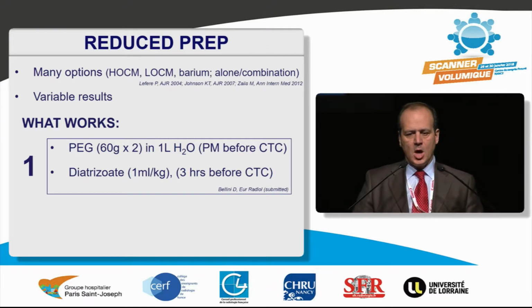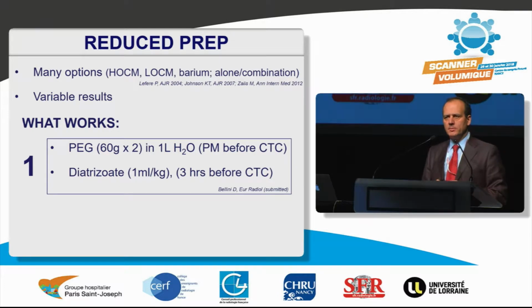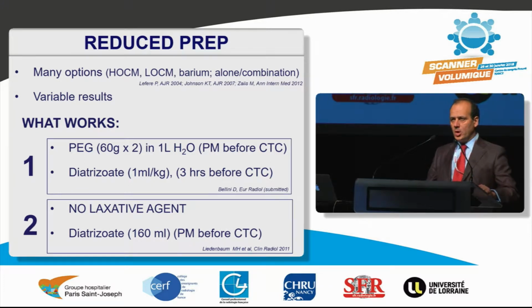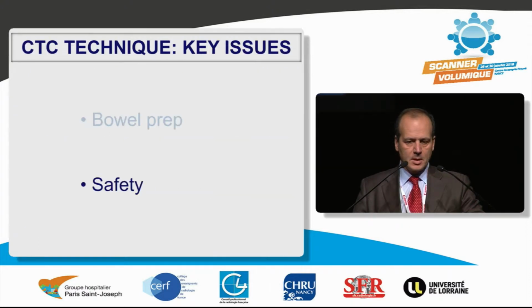examination. Of course, on the day of the exam, you can deliver a hyperosmolar contrast medium, 1 milliliter per kilogram of body weight, so you minimize the volume, and you take your examination 3 hours later, and you get good quality. Or you can avoid using laxative at all, and of course you need to use the day before a hyperosmolar contrast medium at a higher dose, at least 160 ml.